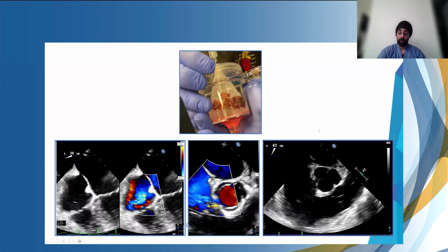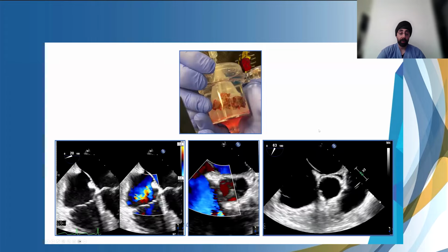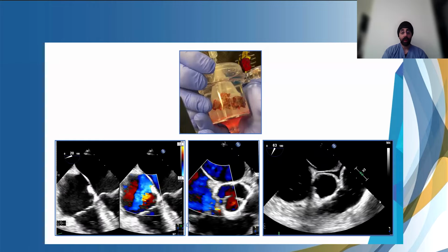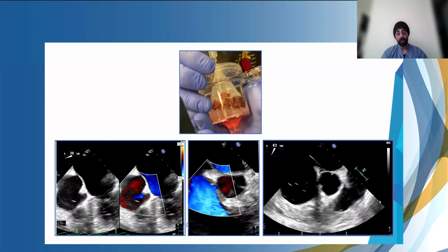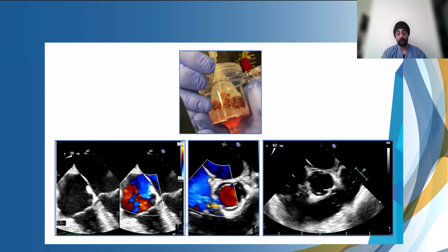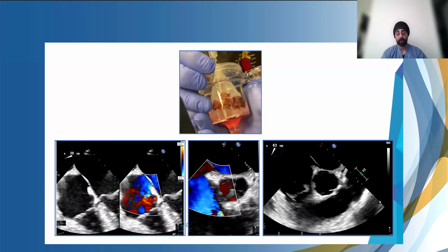I want to take one quick second to talk about one other approach that is quite common, for lead-related endocarditis or infectious endocarditis. That's a situation where we work in concert with our EP colleagues, doing this in concert for lead removal. So that's just something else to keep in mind.